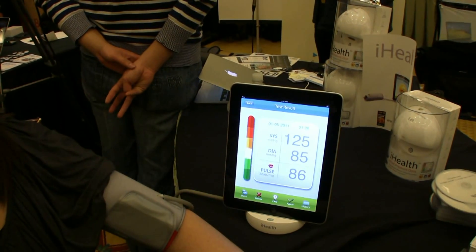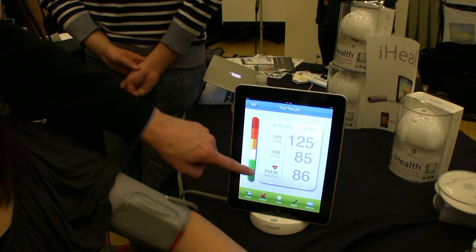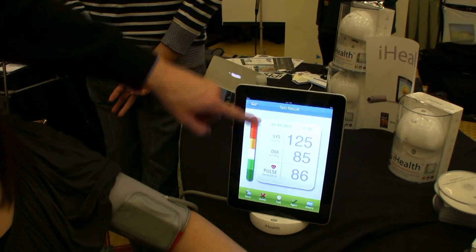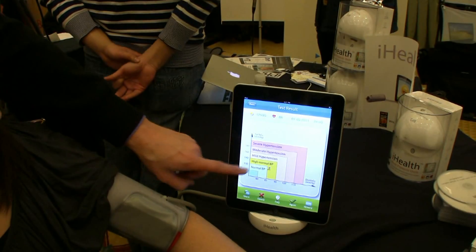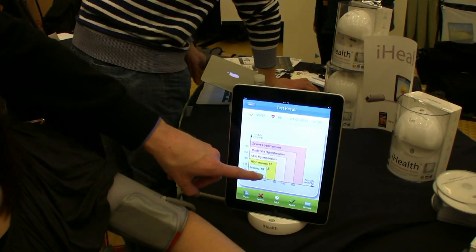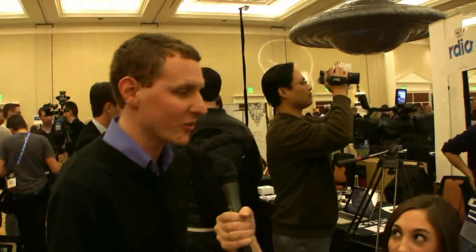And right there, we see that the CES has gotten to her, and it's actually not that bad. We can see it's flashing yellow, and if we scroll up, she's just on the borderline to high normal. So she's pretty normal, and given that it's CES and she's going through all this stress right now, that's pretty good.